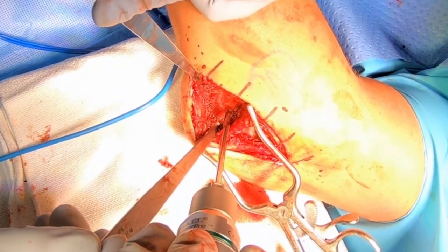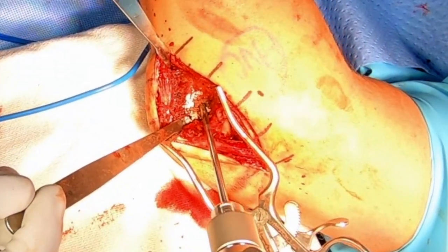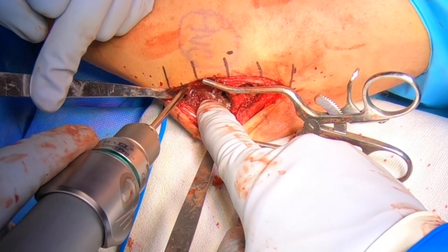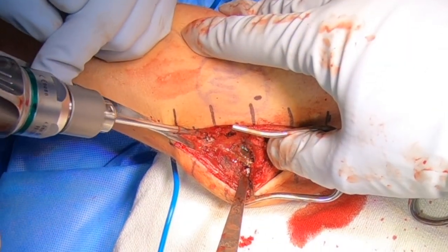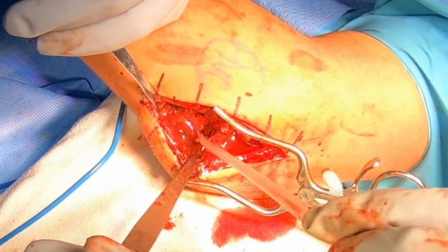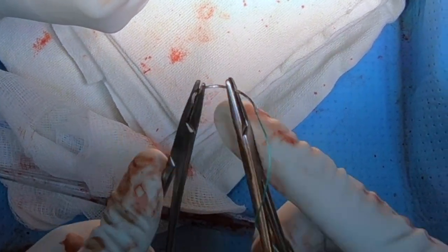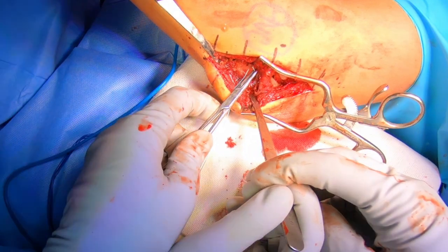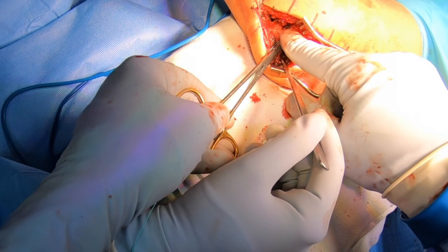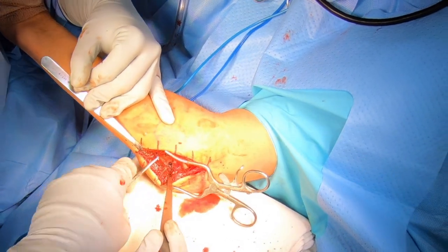The first thing we need to do is drill holes on the lower arm bone side. We'll drill two holes and connect them together to create what's called a tunnel. We're going to take our graft prepared earlier from the forearm — it's a tendon called the palmaris longus that you don't need — and pass it through that hole. First, we'll get all that bone dust out of there, and then we're going to use this suture on a needle. The needle will bend just a little bit so that it fits perfectly between those two holes. We pass that into one hole and then grasp it from the other, bent to exactly the same radius of curvature as the distance between the two holes.